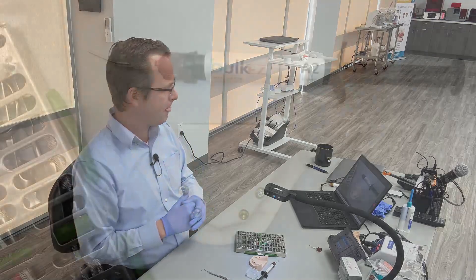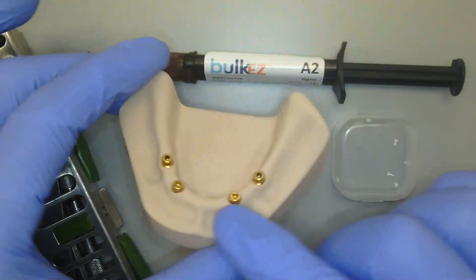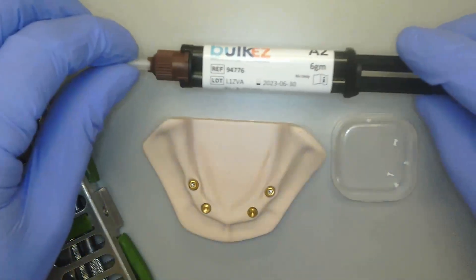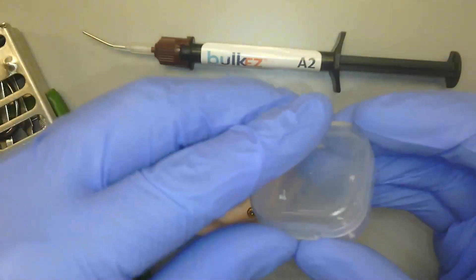In front of us here, I've got some bulk easy plus material as well as my curing light to go ahead and finish up the procedure. Let's dive right in. We have our educational model here with my recently placed locator abutments and my locator angled abutments. I've also got my bulk easy plus material and some PTFE little pellets.